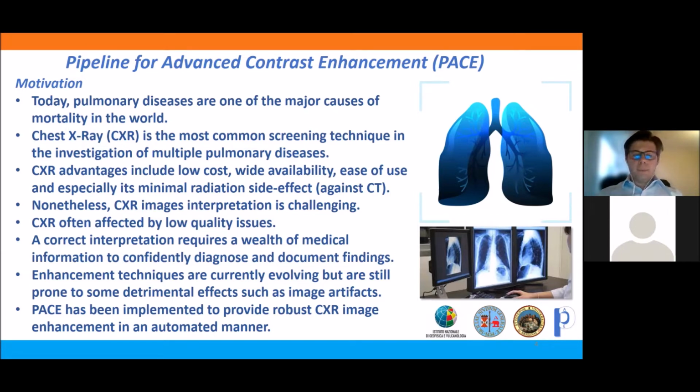A correct interpretation requires a wealth of medical information to confidently diagnose and document findings. In this way, enhancement techniques are evolving, but are still prone to some detrimental effects, such as image artifacts. That's why, with this in mind, PACE has been implemented to provide robust chest X-ray image enhancement in an automated manner.